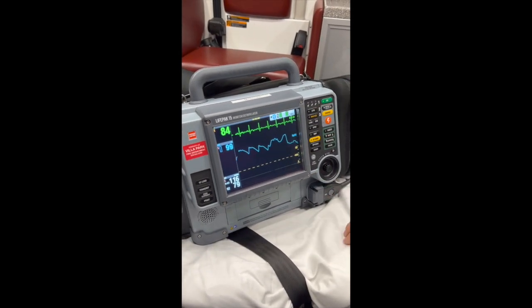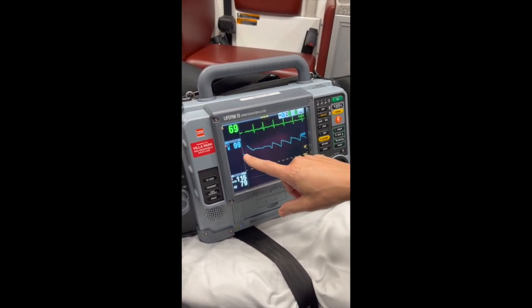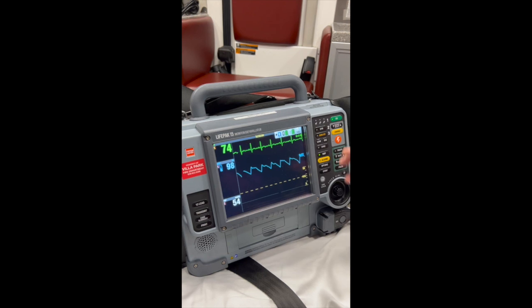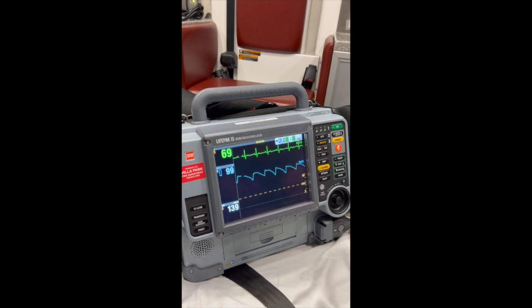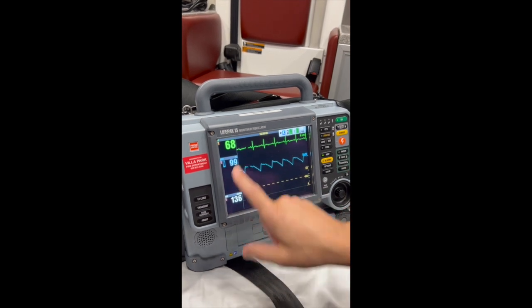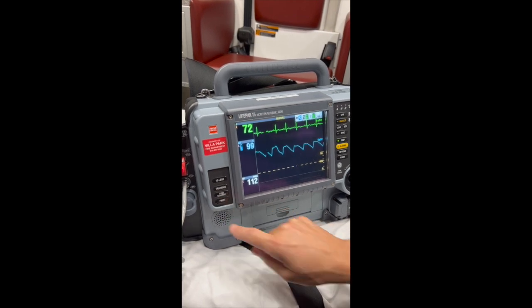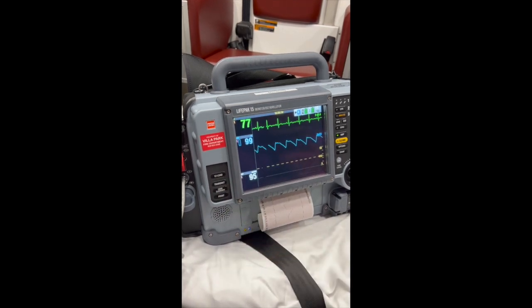You can also send your monitor data. So if you're doing vitals, blood pressure monitoring, your SpO2, or even capnography and you have a capnography waveform, the monitor is going to take those vitals every 5 minutes. You can initiate a new blood pressure and grab vitals sooner by hitting the blood pressure button, but otherwise every 5 minutes it will take those vitals. Those vitals are stored. If you want to get an EKG reading for the hospital or for your report, you do have to hit the print button. That'll capture the strip, and that way it'll import into your report.